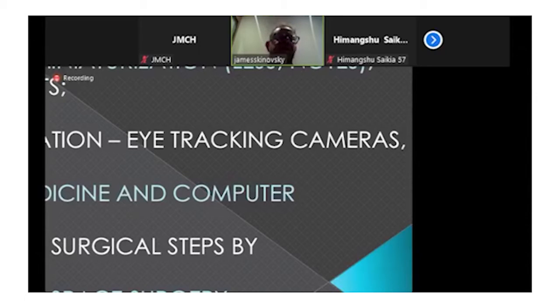About the new platforms that are coming, all of them are looking to reduce costs. It's quite important to reduce the size of the platform. We are going to see here that all of them are running for miniaturization, including the use of laparoscopic single-site surgery, single-port surgery, NOTES, surgery by natural orifices, and so on, to improve movement, making them more flexible, the haptic feedback, as we talked, the biometric integration, or the use of eye tracking cameras, head tracking, which we can call open console. So the surgeons are going to have a more interactive and natural experience.